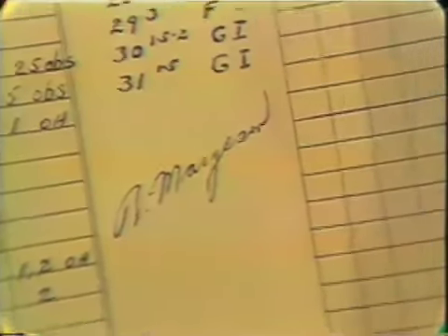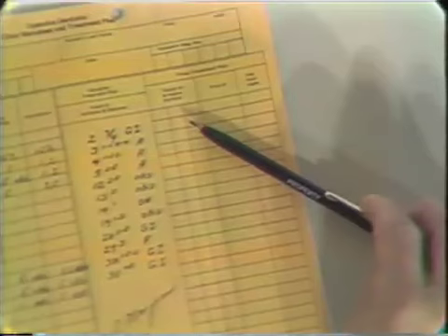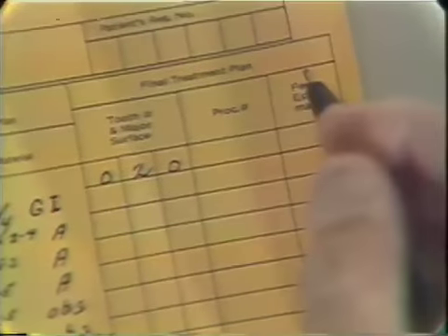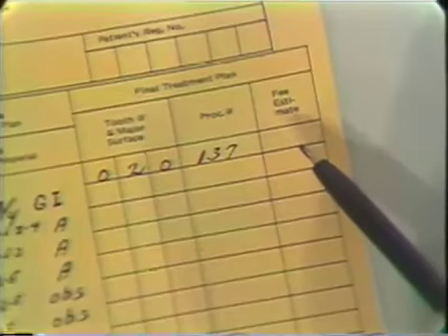The final treatment plan is entered as to the order in which you will do these restorations. And so a further decision is made as to which restoration will be done first. In this case, perhaps we will do number 2 first. The tooth and major surfaces is in the first 3 columns. Tooth number 2, it has no mesial or distal major surface, so a 0 is entered. The 3/4 crown is number 137, and then the fee estimate is checked in your clinic procedure manual.